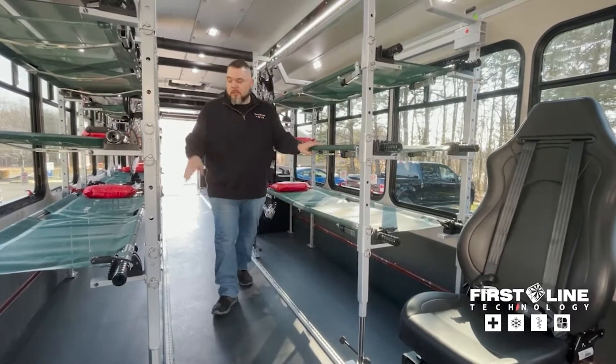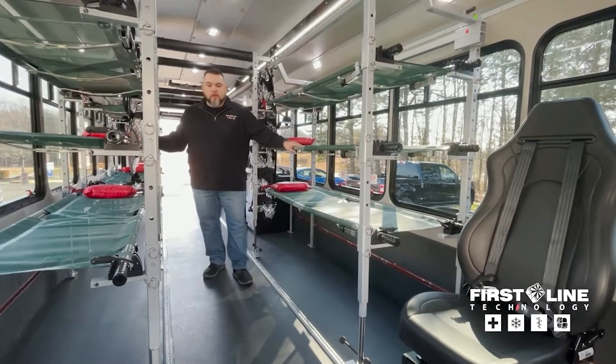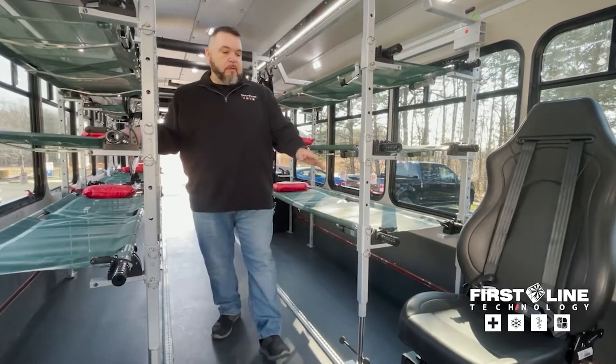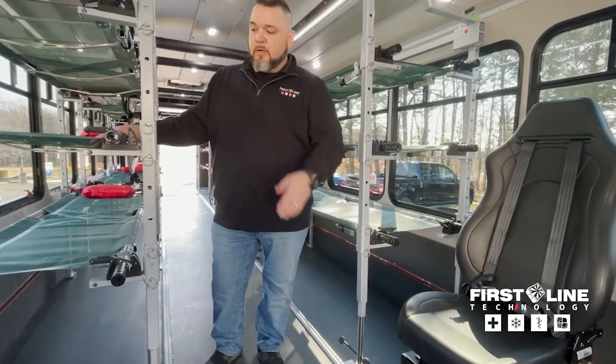On these stretchers that you can see right now, we have pillows on each one of those. You can also get those with gurney bags. And up front here are installed our ambulance seats.